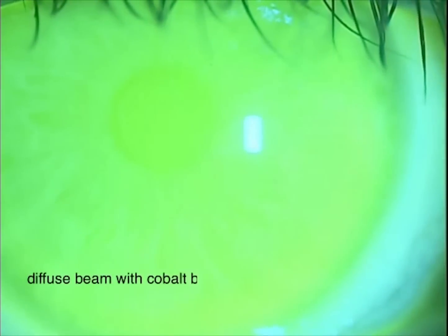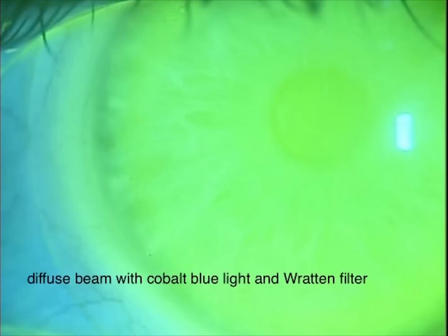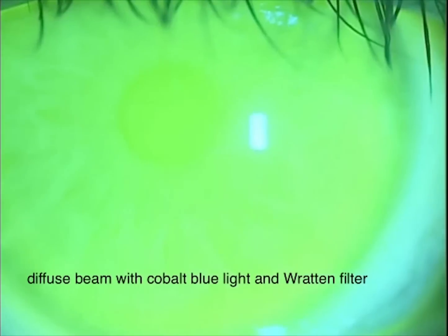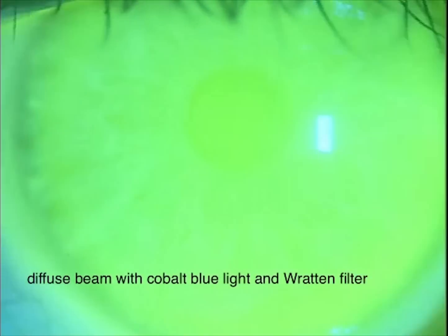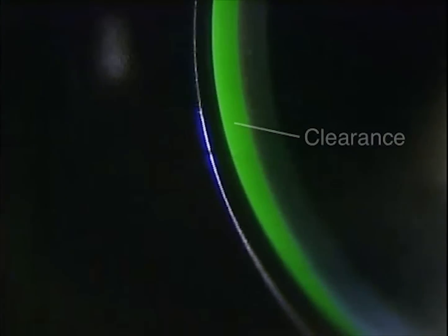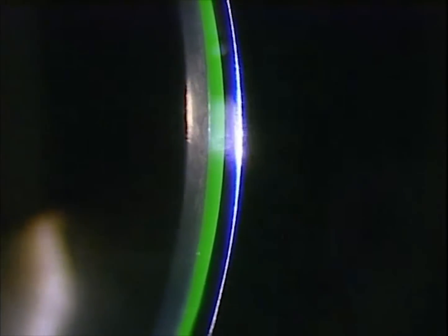This video demonstrates an optimal central clearance. It's a lens viewed with a diffuse beam utilizing a cobalt blue light and a wratten filter. Fluorescein was placed in the bowl of the lens before insertion. As you can see, the details of the pupil and iris aren't easily seen. When you view this lens with an optic section, you can see the fluorescein between the posterior surface of the lens and the anterior surface of the cornea. Knowing that this lens is 350 micrometers thick, you can estimate the thickness of the fluorescein, which represents the amount of clearance — approximately 350 micrometers centrally.